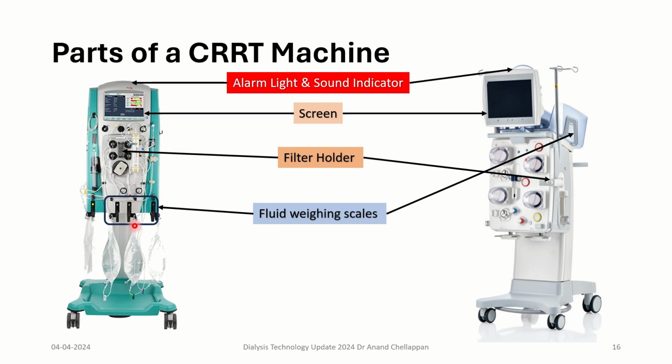So these are very sensitive scales. If there is any disturbance adjacent to these scales or movement of these fluids, it can interfere with the machine's interpretation of the fluid usage, and it can also give alarms.